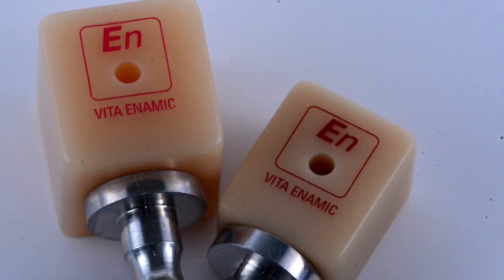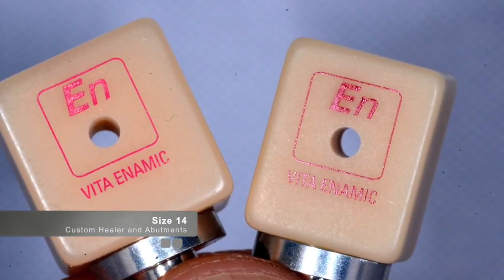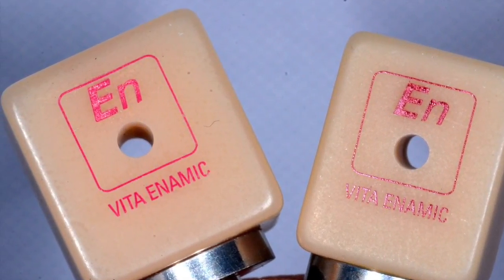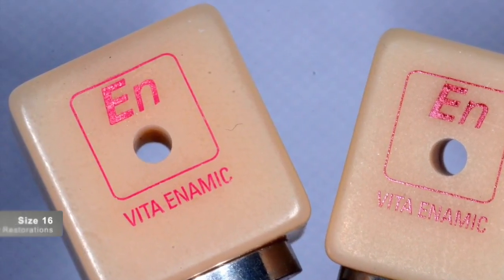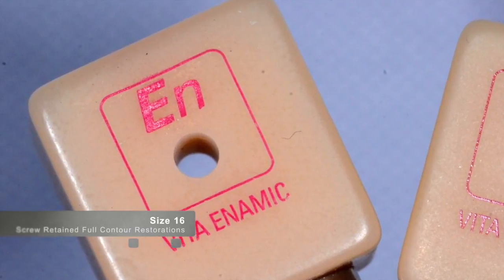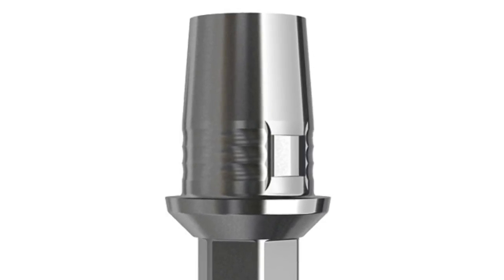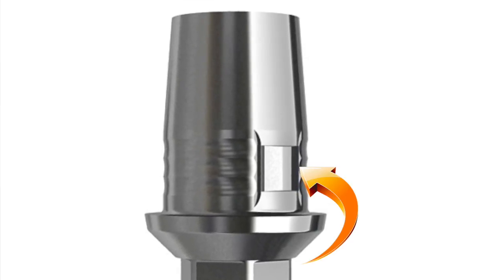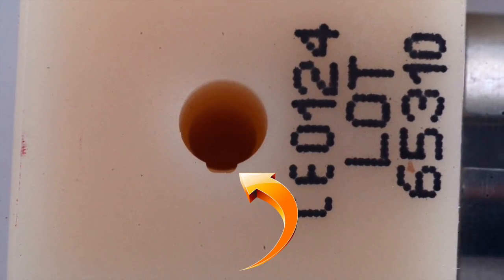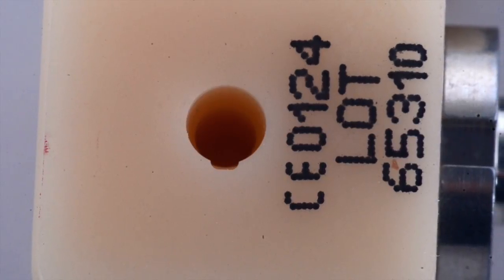This is what makes the implant solution blocks from Vita Enamic so interesting for the clinician to consider for their final restorative choice on top of their implant restorations. The Enamic blocks are used in the normal CEREC implant workflow. These blocks are supported by a titanium base which is screwed into the implant. The blocks are indexed on top of the titanium base — called the tie base — which has a male notch that matches with the female notch in the block. This indexing prevents rotation of the restoration on top of the titanium base.